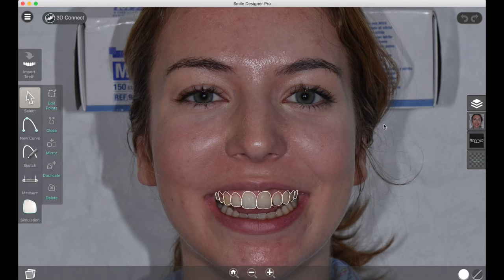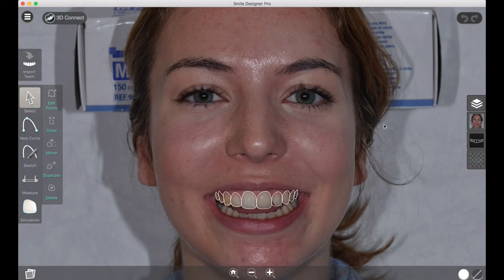In cases where the simulation is showing a smaller change — if it's a smaller case or you're doing one, two, or three teeth — you're going to want to use the patient's own teeth in the photo as a source for simulation. So let's dive right in.